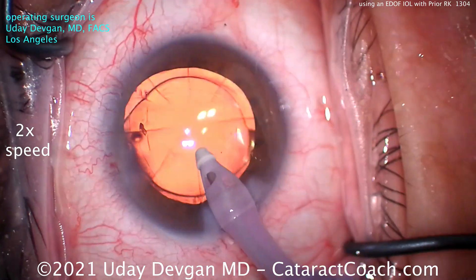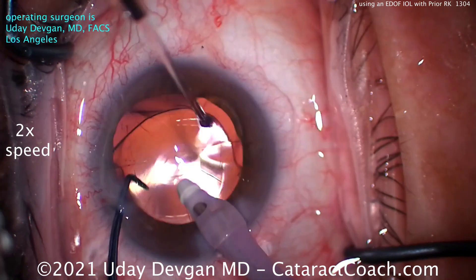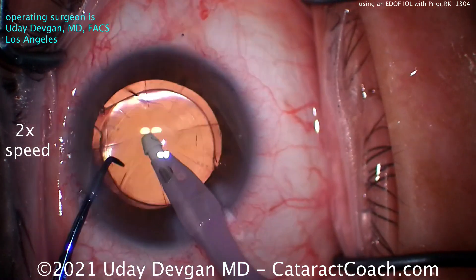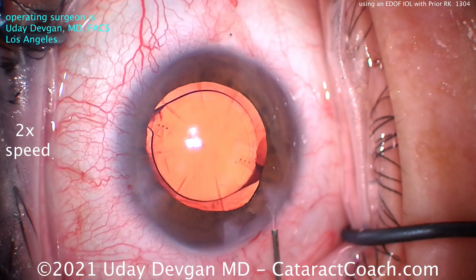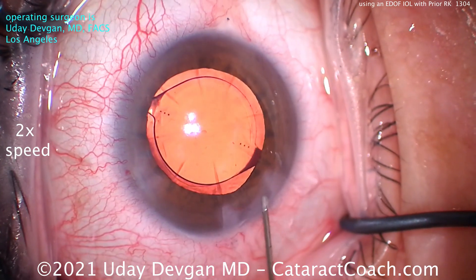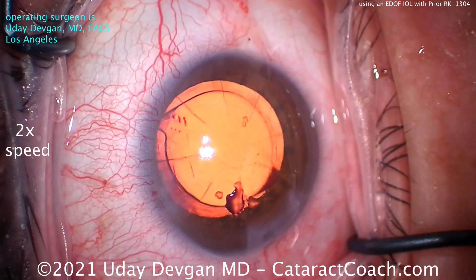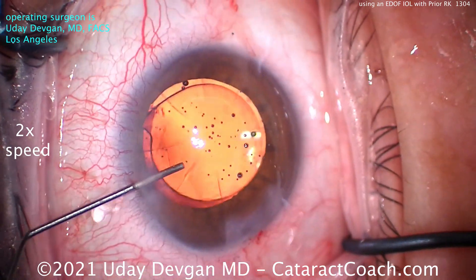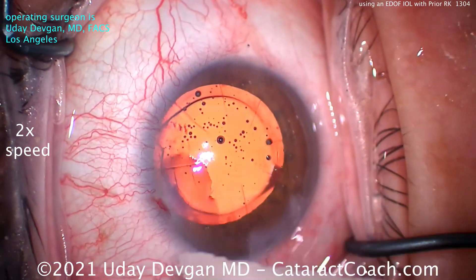I'm happy to say this patient had a really nice outcome and was very pleased. You can see the EDOF central beam shaping element. I want to thank Dr. Wong for his contributions to our learning — we keep learning throughout our careers. I now have more of an open mind with regard to placing EDOF lenses like the Alcon Vividi in patients with prior RK or even higher degrees of prior LASIK, as long as the corneas centrally have pretty good readings and not too much aberration, and as long as patients have reasonable expectations — we can actually have a beautiful outcome.